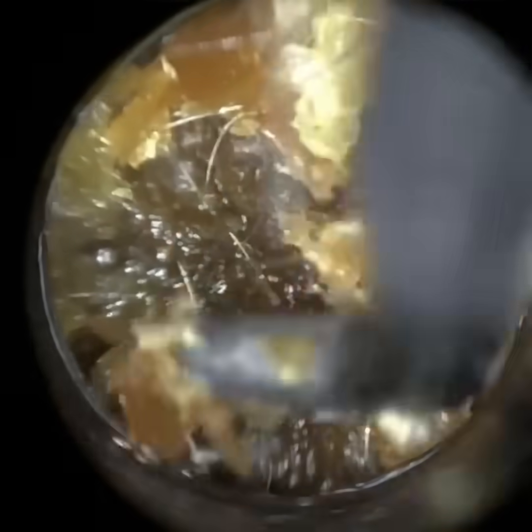I think now I'm going to use, let's see, is it going back to the ear hook again? I just want to separate this a little bit more. I'm exerting quite a lot of force here, and it's still quite difficult to chisel away. I'm just going to go to the roof. I'm going to glide the ear hook in.